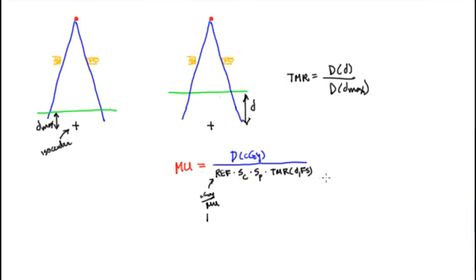Okay, so there are also some other factors on the bottom that are sometimes needed. Let me write those out. So you have the wedge factor, if there's a wedge in the beam, the OAR, the off-axis ratio, and also the tray factor, if you have a tray in the beam for blocks. So I think I'll run through an example of how to do a calculation, but first let me explain a little bit what these SC and SP factors are.